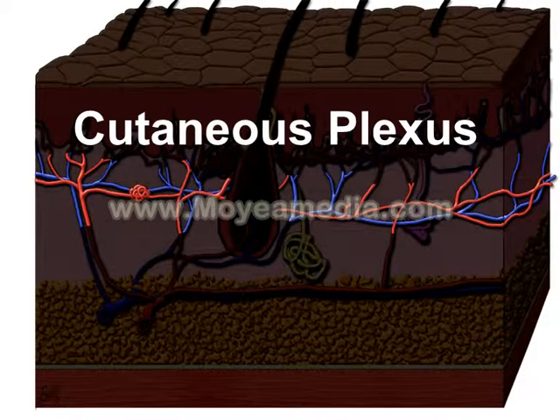The intervening cutaneous plexus is composed of perforating vessels and is really sort of a no man's land in terms of discussion of superficial and deep infiltrates. Both can involve the perforators, and so when we talk about superficial, we really talk about the superficial plexus and the postcapillary venule, and superficial and deep as being both that level and the vessels at the dermal subcutaneous junction.